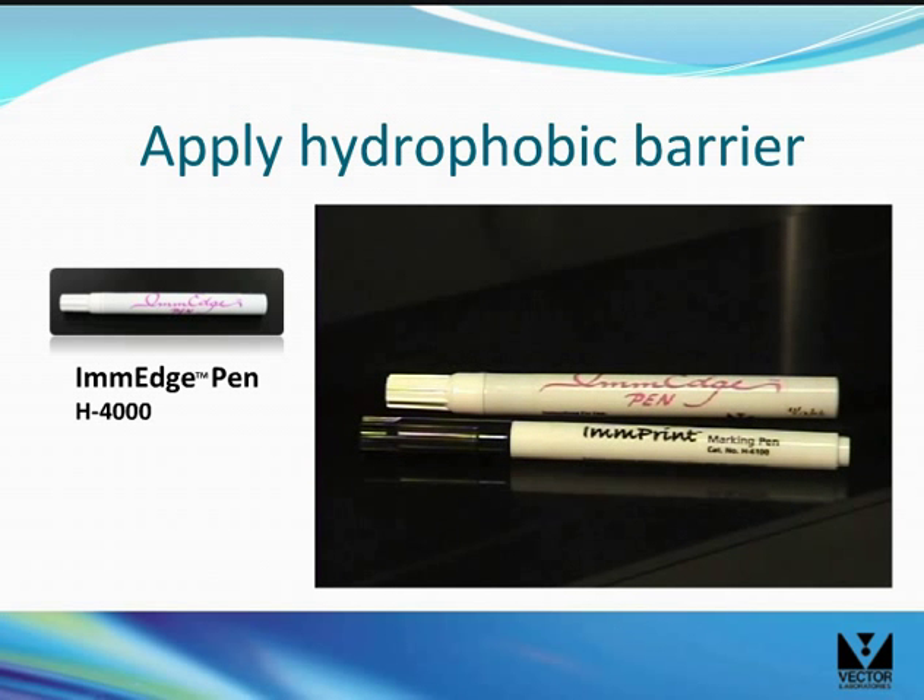Use the ImmEdge hydrophobic barrier pen to apply a waxy barrier to the slide. This barrier will localize the antibody solutions to the section, allowing you to use less solution per section or to use different antibody solutions on different sections on the same slide.